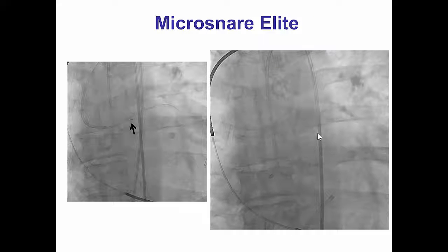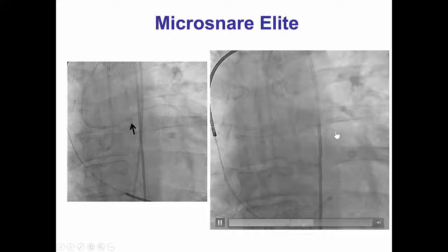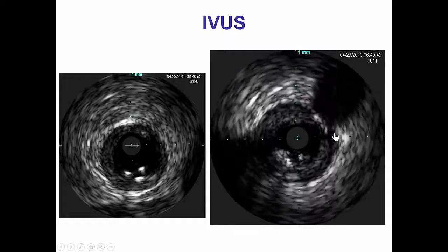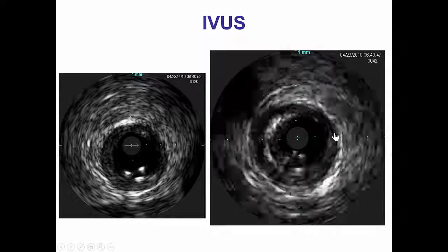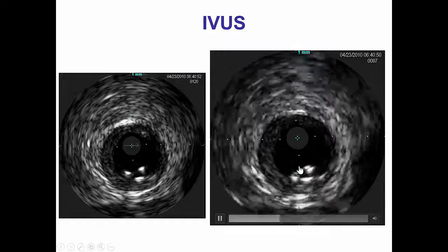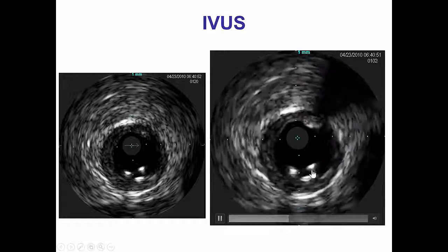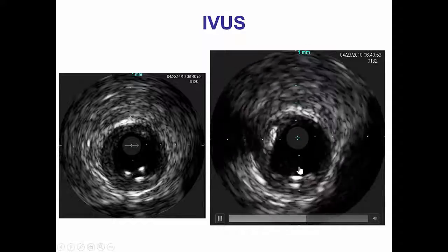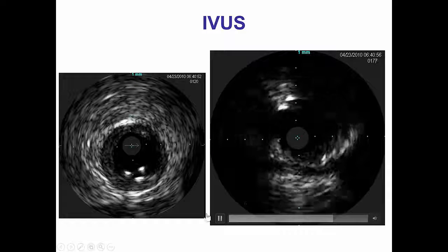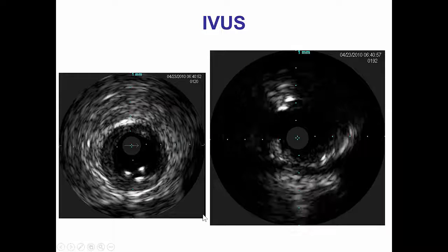In this particular case, we could not snare the stent, and in the process we actually lost the guidewire position. So we had to rewire in the left main and perform intravascular ultrasound, which demonstrates the lost stent sitting in the lumen of the left main and coming back all the way into the aorta.